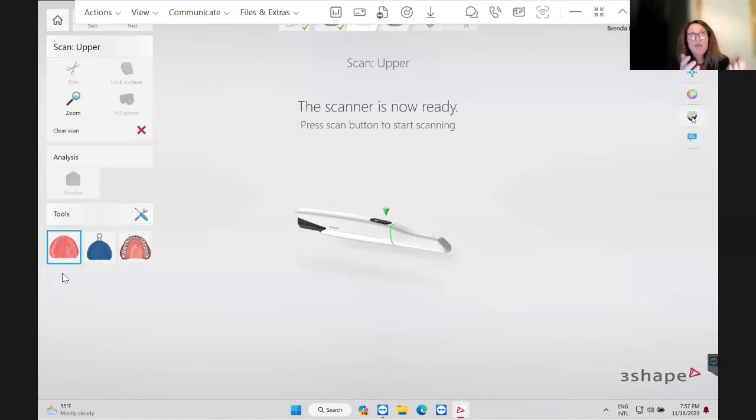So if you're torn between, is this patient in the A range or the C range, it will help you. But a lot of times, if you've been doing it for a long time, I think your eyes are better. To begin with, or when you have five different shade guides out and you can't figure out which one it is, that's a really good tool. That's me, I become indecisive. And I should just go with my gut. Then the patients will say, but I want to whiten.